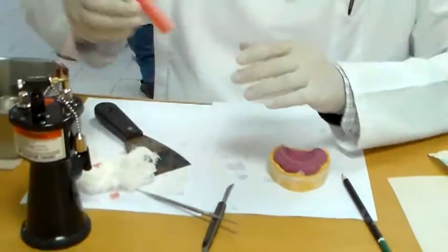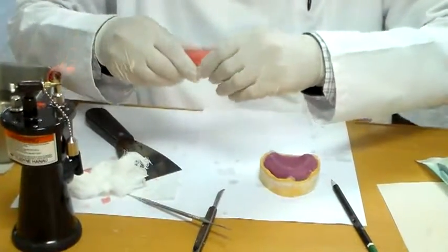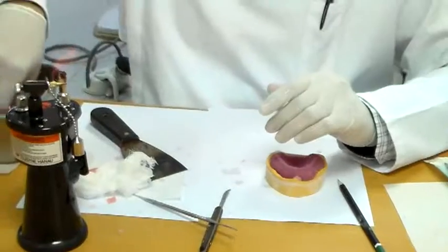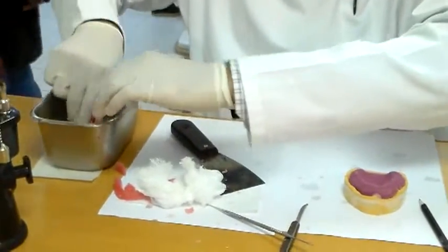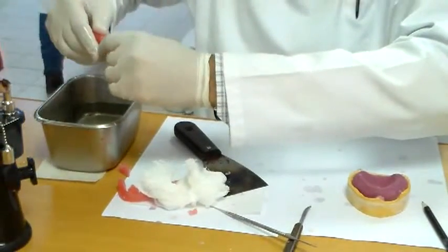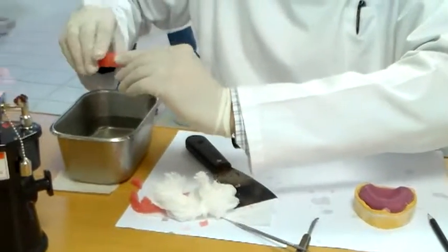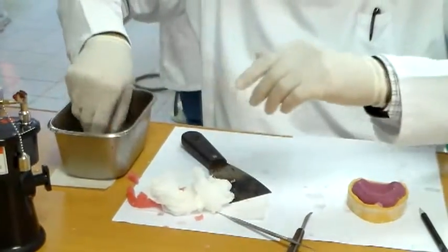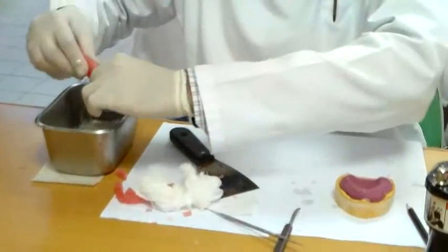Okay, so I finished rolling up my occlusal rim, my wax. I want to use the hot water to soften it, flatten it a bit. This side.